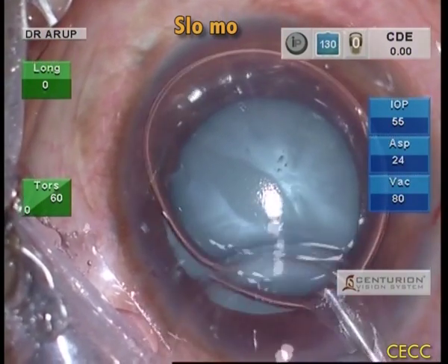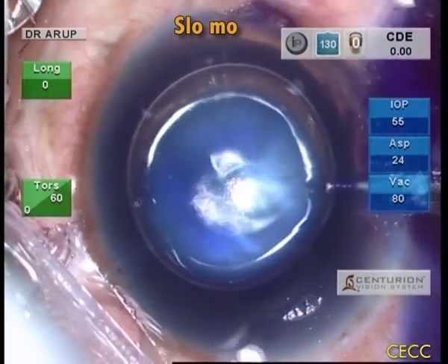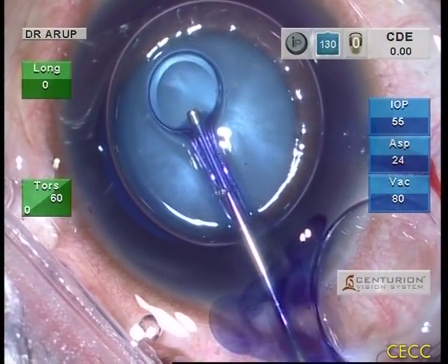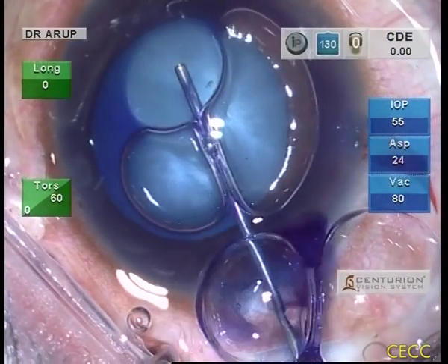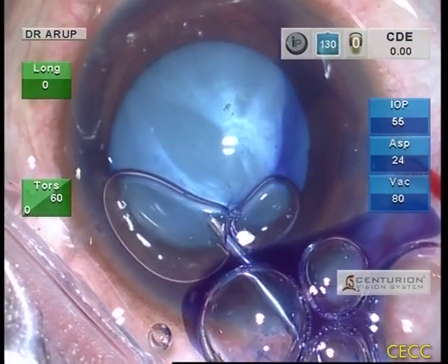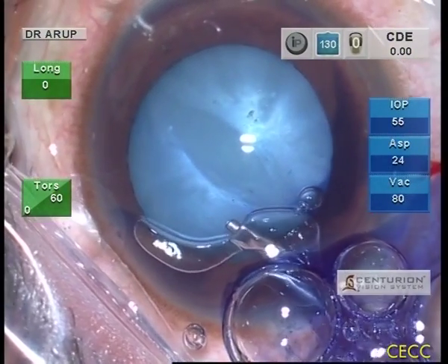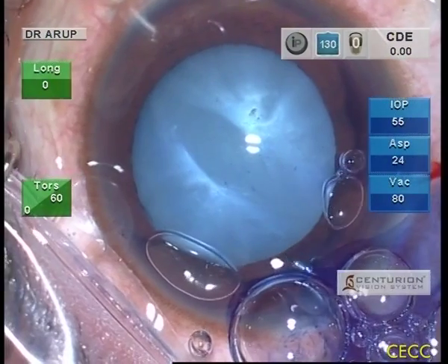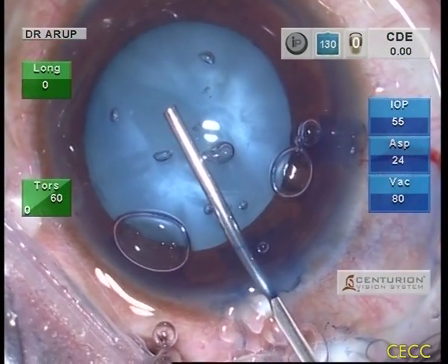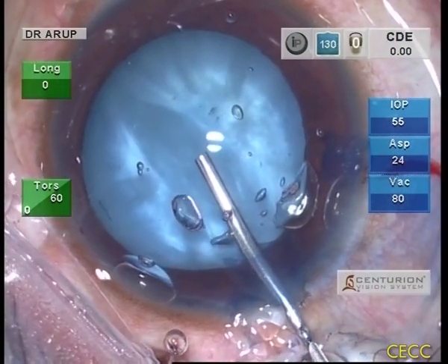The anterior capsule is stained with 0.06% trypan blue under an air bubble, because visibility is paramount during RHEXIS in such challenging cases. A modified soft-shell strategy is planned wherein first a dispersive OVD is injected into the anterior chamber. The anterior capsule is then flattened with Healon V injected just in front of the capsule. It is important to render the anterior capsule flat or even concave for a safe RHEXIS.